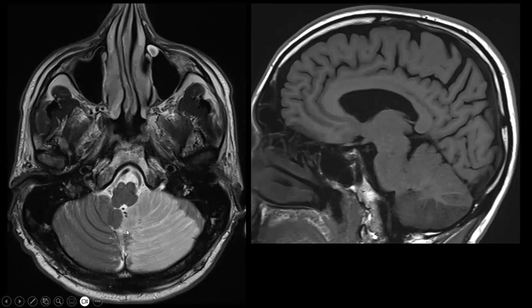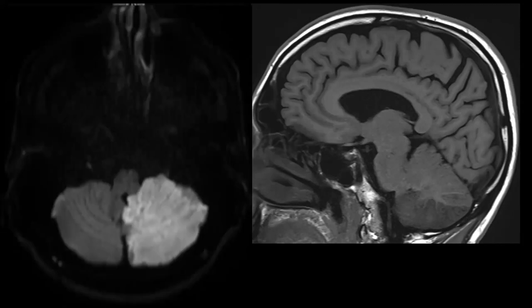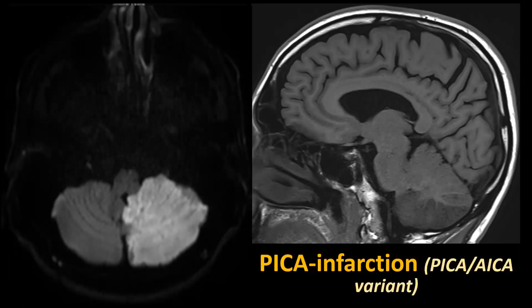This is a patient with a very extensive infarction involving the inferior part of the cerebellar hemisphere, and notice that most of the medial part, but also the lateral part of the inferior cerebellar surface is involved in this patient, and as such, you have a lot of variability in the vascular supply of the inferior surface of the cerebellum. This is going to be a dominant posterior inferior cerebellar artery in a patient with presumably a hypoplastic ipsilateral anterior inferior cerebellar artery. So the size of these infarctions can vary considerably depending on the variation of the vascular supply.